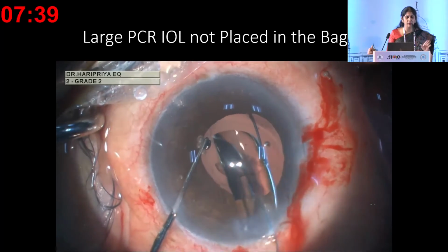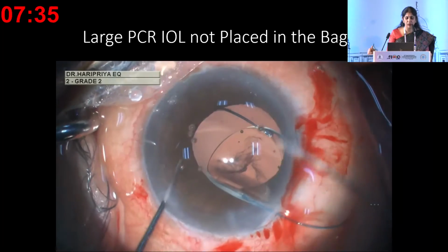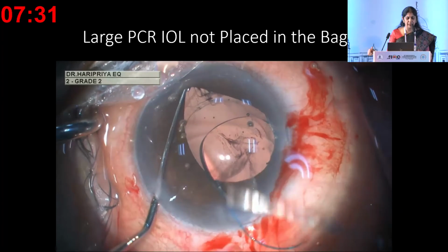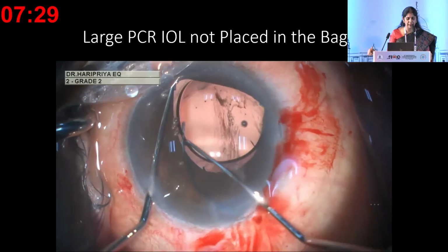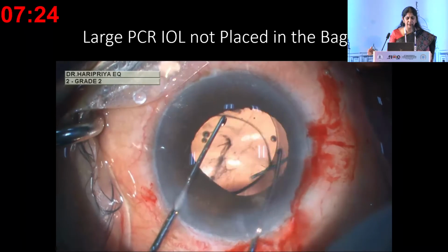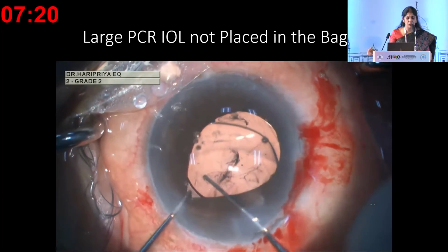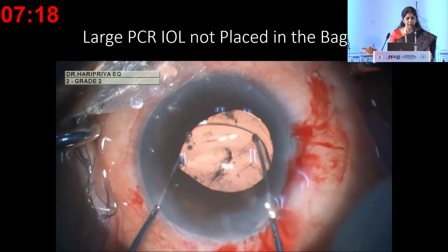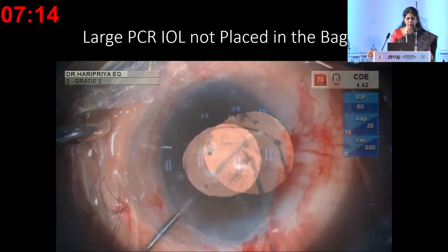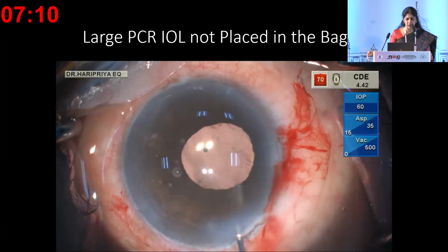Again, you'll have to see where the haptic goes. We cannot blindly place the IOL like we would do if the PC was intact. So while implanting the leading or the trailing haptic, retract the iris with your Kuglin's hook or a Y hook, and then you place your IOL in the sulcus and optic capture. With 3-piece IOLs, if you're placing it in the sulcus and you have the adequate size, if it's very large, of course you can't capture, but in most phaco-rhexis you can capture the optic in the rhexis margin.